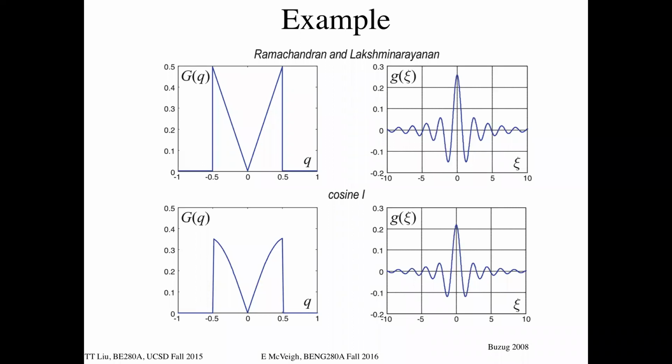Yeah? I guess it does kind of make intuitive sense because we're kind of sharpening the image, which is reducing low frequencies and increasing high frequencies. Absolutely. So the center, which is the low frequencies, is 0, and then the edges are boosted. Boosted a lot, yeah.